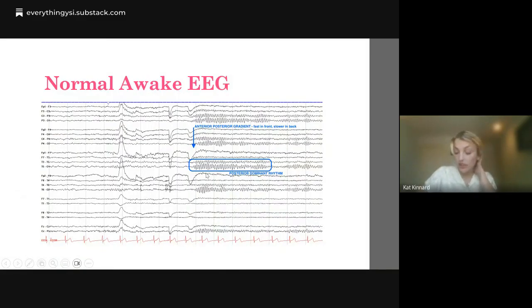When looking at an EEG, it's a little daunting at first. However, you're looking for, is it symmetrical between the left and the right? So remember, the odd numbers are the left side of the head, and the even numbers are the right side of the head. So this montage, or this organization of the waves, puts the left side of the head over the right, and so you're easily able to compare the two.